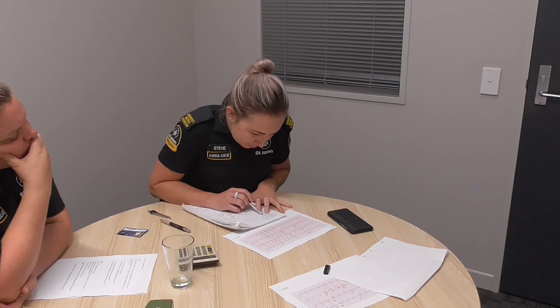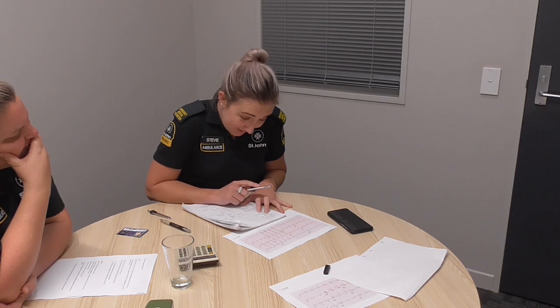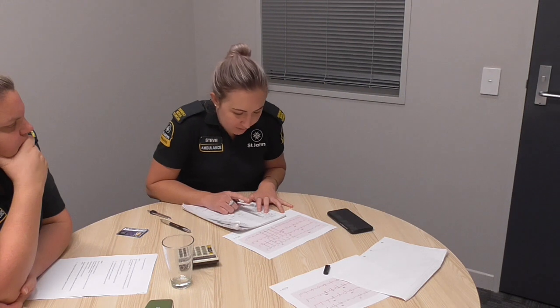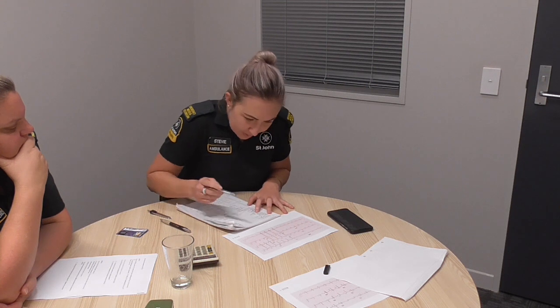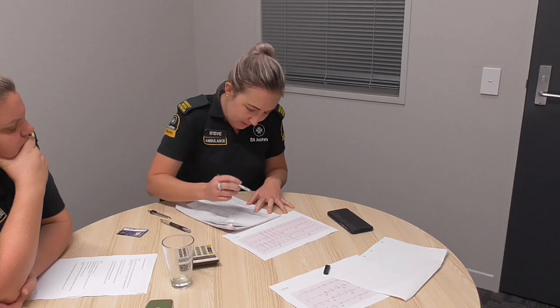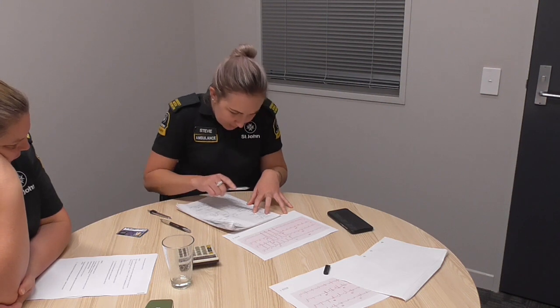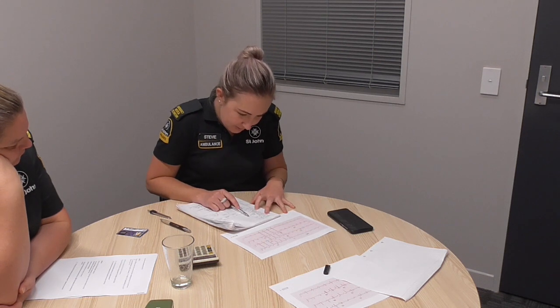Paper speed again should be 25 millimeters per second. It's not listed here. Frequency should be 0.05 to 150 hertz. That's not here either. Calibration spike is present and at 0.2 seconds, so that's good. Time, I don't believe we were given a time, and it's not listed on here. This is a nice tidy 12 lead, so that's good.